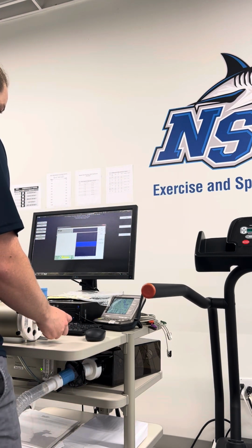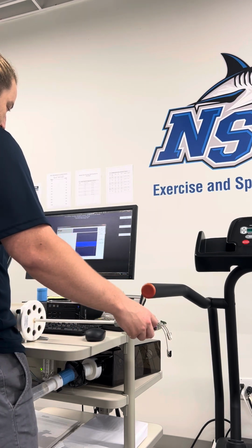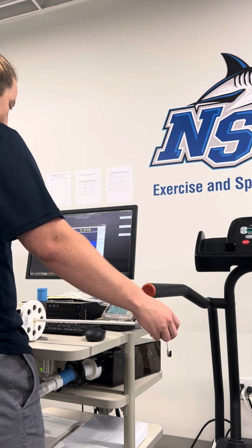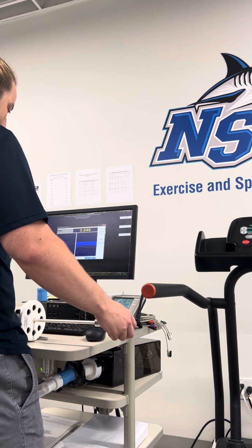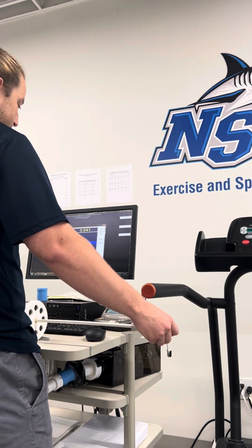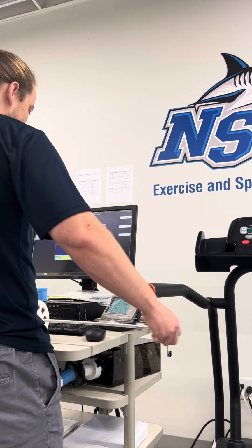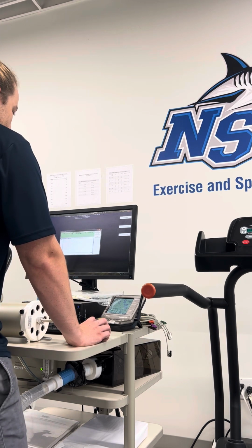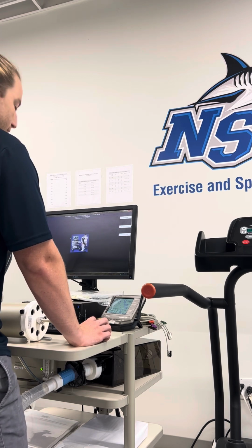So I'll do 5 strokes right here. First one nice and slow. Each one will get a little bit faster. Looking there at 3 liters, that's exactly what we're looking for. 100 to 200. There's 200 to 300, get closer to 3 liters. There's 300 to 400. One last one. A change of under 2.5%, and I'm good to go. Hit save. Boom.